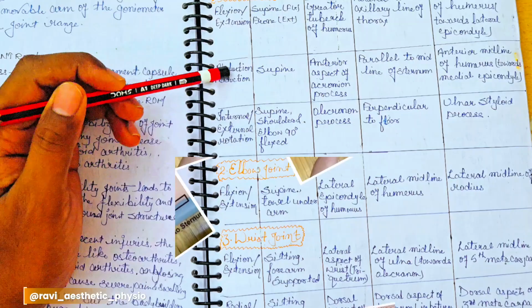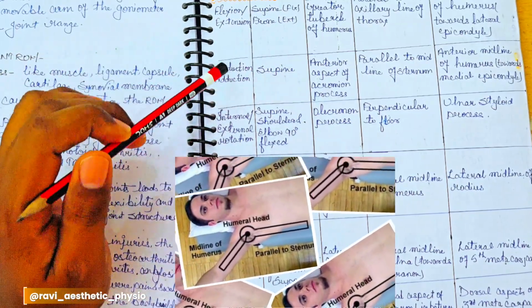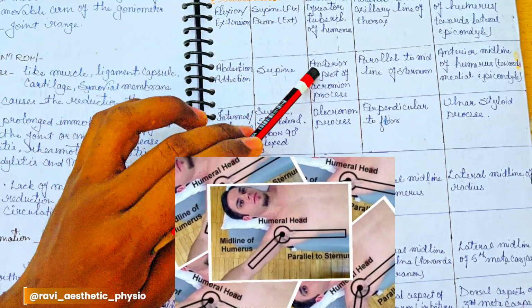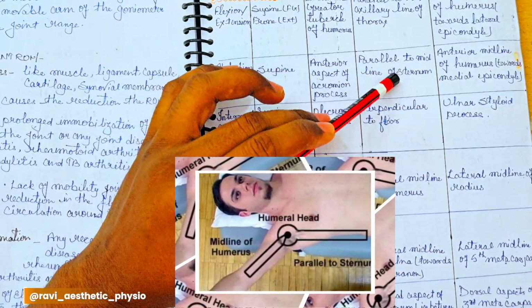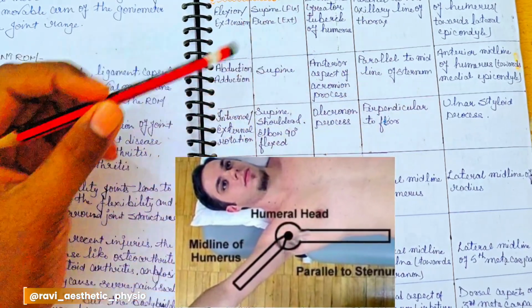Next, in the shoulder joint, abduction movement. In abduction the patient position is supine, and in adduction the patient position is also supine. The fulcrum position for both is the same, the anterior aspect of the acromion process. The stationary arm is parallel to the midline of the sternum, and the movable arm moves with the anterior midline of the humerus toward the medial epicondyle.